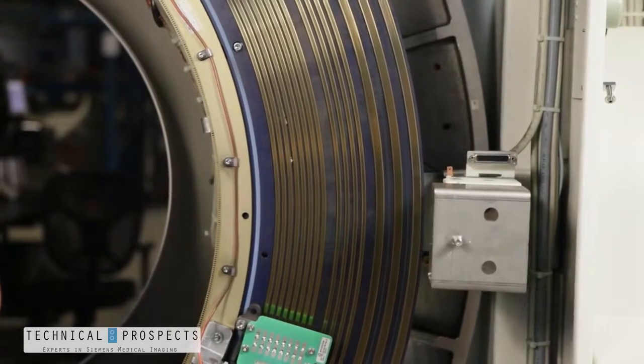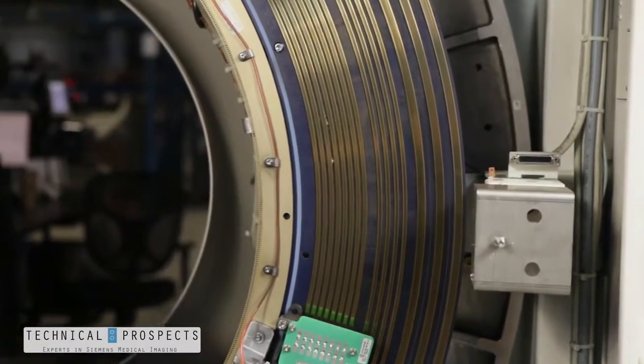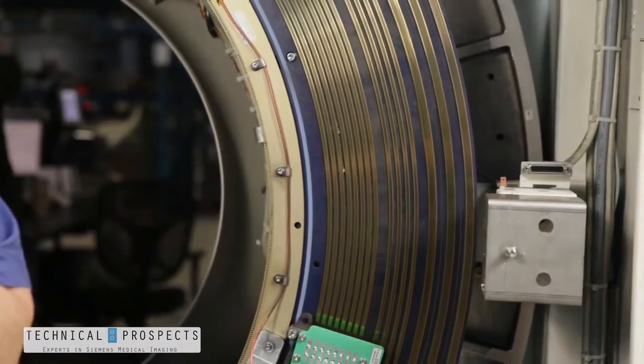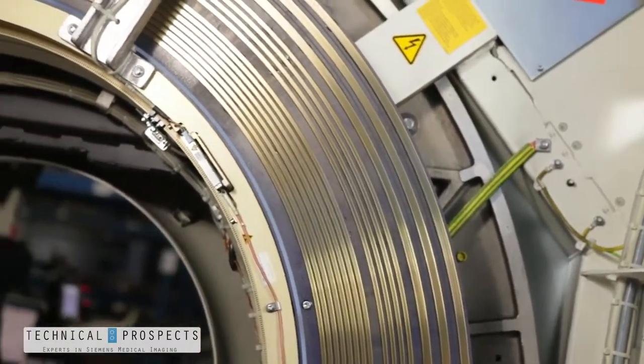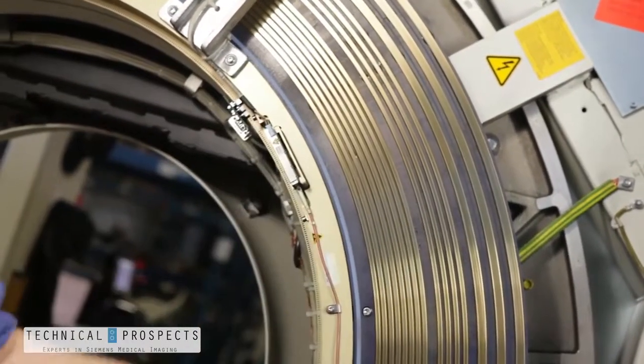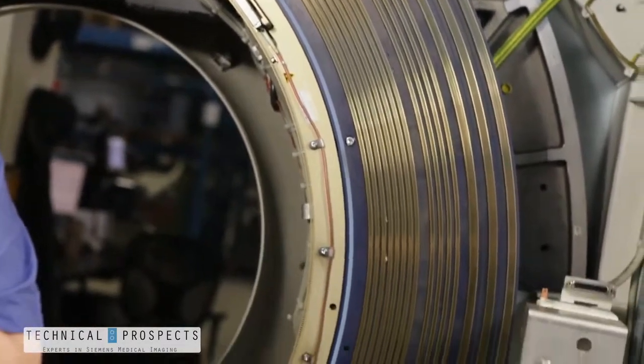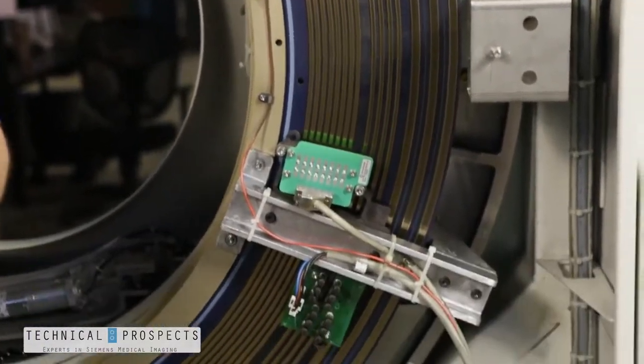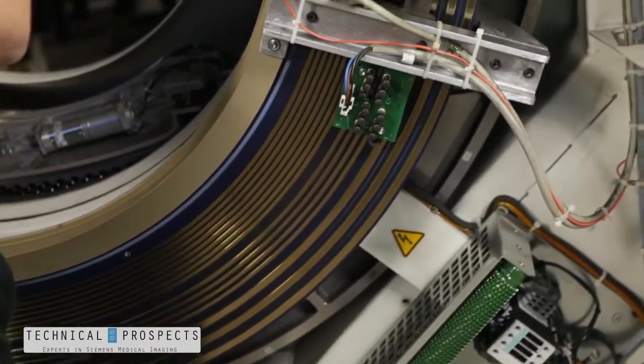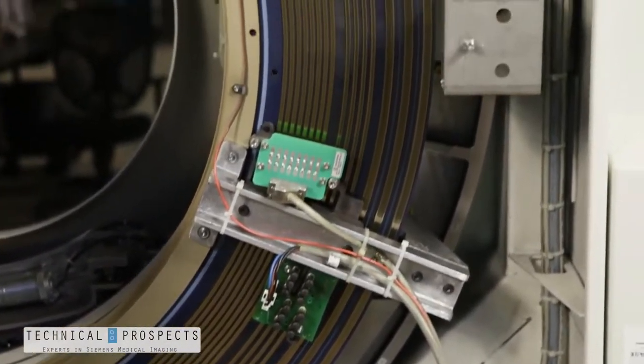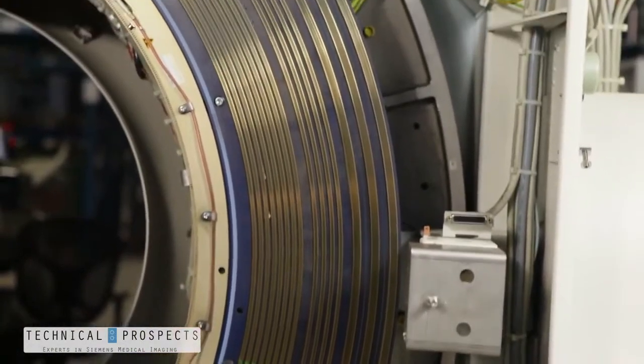You would first vacuum the slip ring with your HEPA vac. Second, you would apply liberal amounts of denatured alcohol to a lint-free cleaning rag and use a broad sweeping motion to polish the ring in a circular fashion. Remember that if you're working from the back side of the gantry, you rotate the gantry in a counterclockwise rotation if necessary so that you continue the rotation of the system in the proper direction.